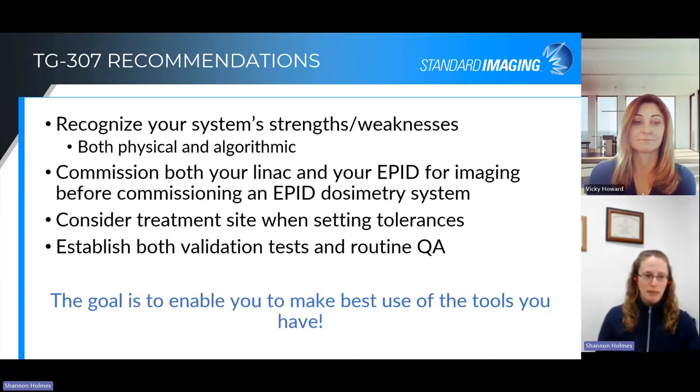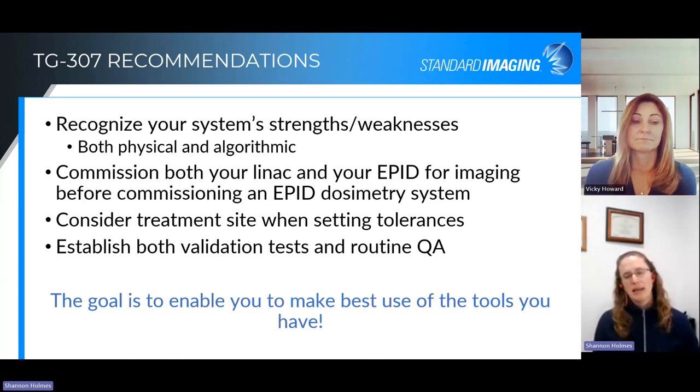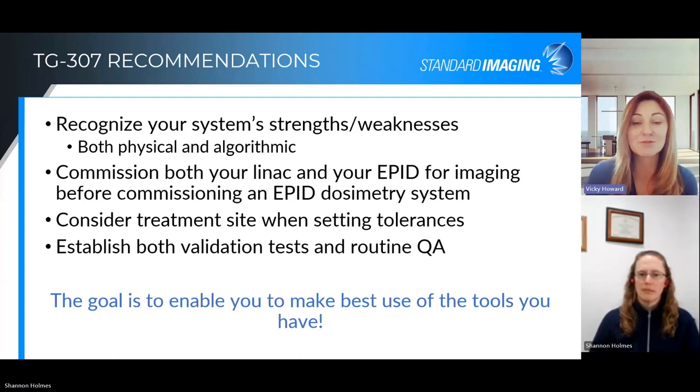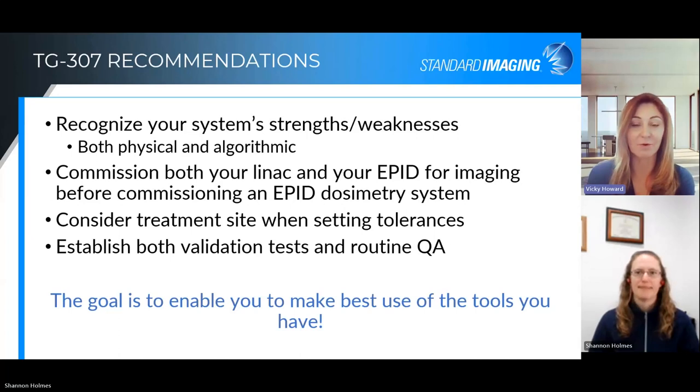Recommendation number two is, as I mentioned previously, make sure you commission your LINAC and your imager for general imaging use before you step into commissioning an EPID dosimetry system. Consider treatment site when you're setting tolerances or when you're analyzing results. And then, of course, in good physics practice, establish both your validation tests and your routine QA so that those are in place and easy to return to or refer to as you need to throughout the clinical use of this product. Yeah, and of course, the goal is to use the tools that you already have that can be easily integrated into your workflow and add value to your patient-specific quality assurance program.